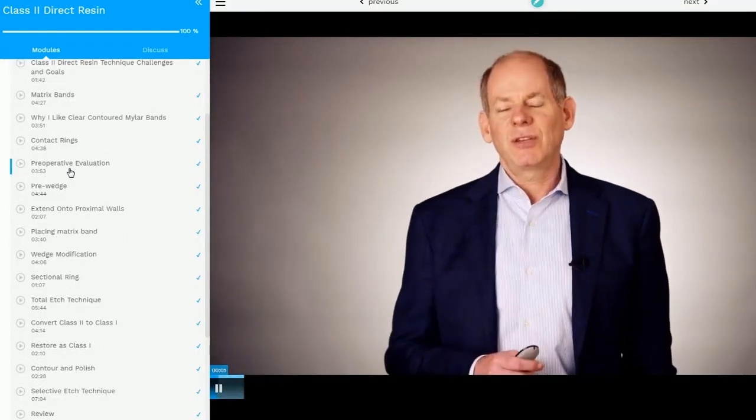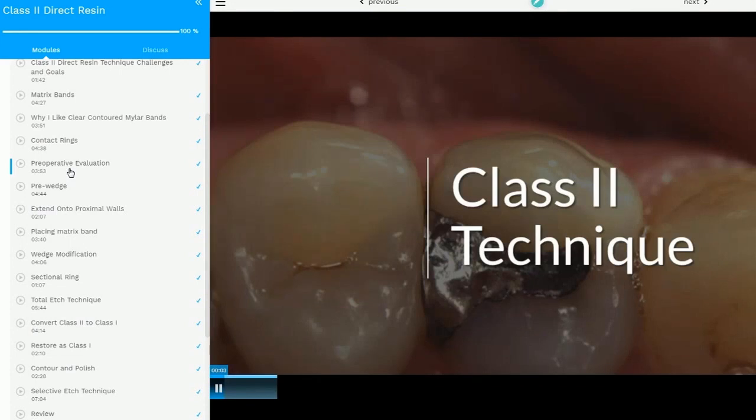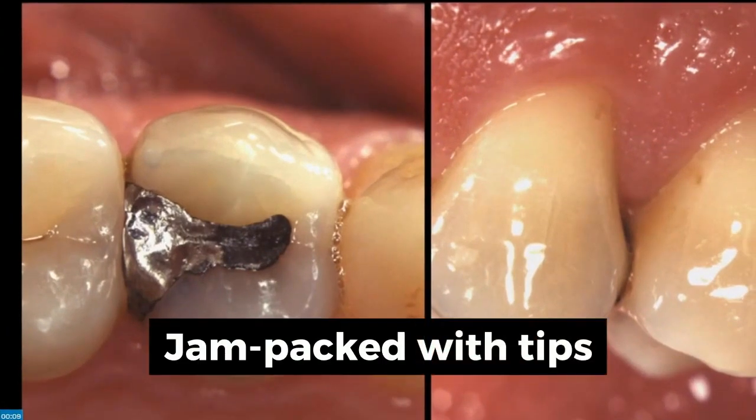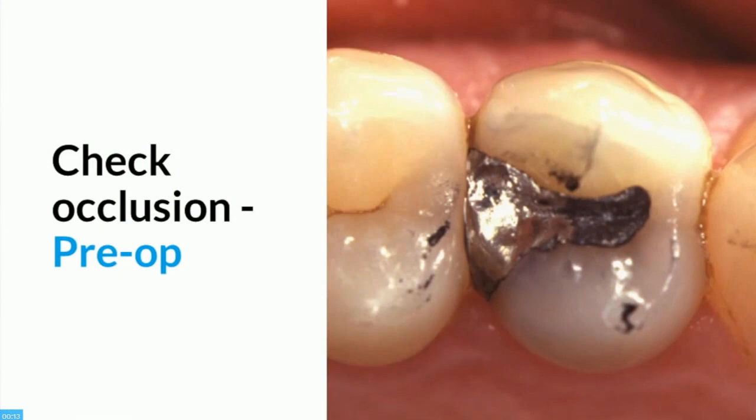All right, let's get into the Class 2 technique. So I'm showing you an upper bicuspid with a failing Class 2 amalgam. One of my tips for you before you start the restoration is to check the patient's occlusion. I'll mark it with articulating paper like what I show on this slide.